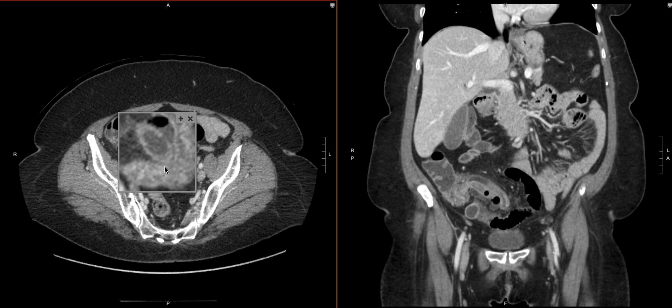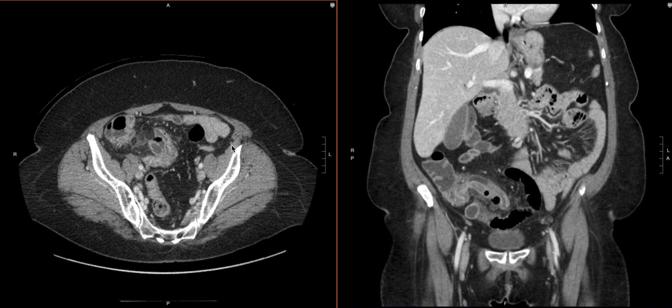This case was a confirmed perforation case. So we have our acute appendicitis, free air, free fluid, and a defect in the wall of the appendix. All of that is a really good look for acute appendicitis complicated by perforation.